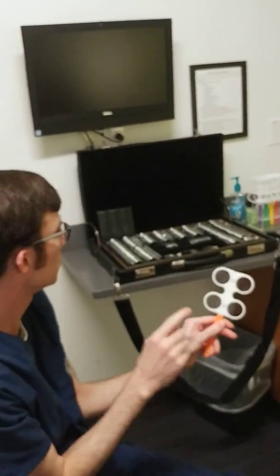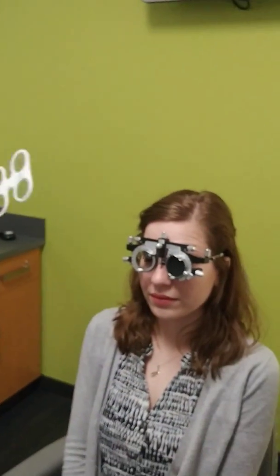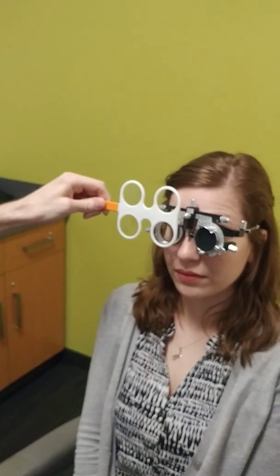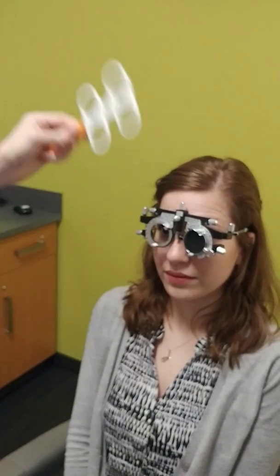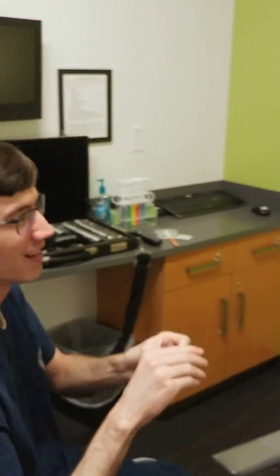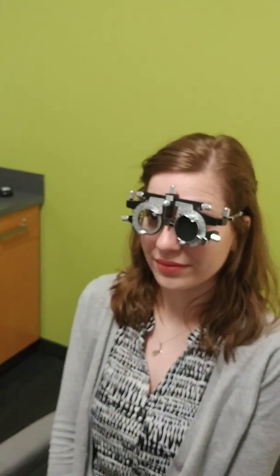The way I like to start is with a really easy choice — grab the flipper lenses that match. This is a plus or minus 2 and she was at 20/200, so that works. I bring the flipper over and usually check with plus first: which is more clear, with the lens or without? She chose without the plus. Then with the lens or without? She chose with the minus. Key point: you want to actually put that lens in the trial frame — you don't just check with other lenses without putting them in.